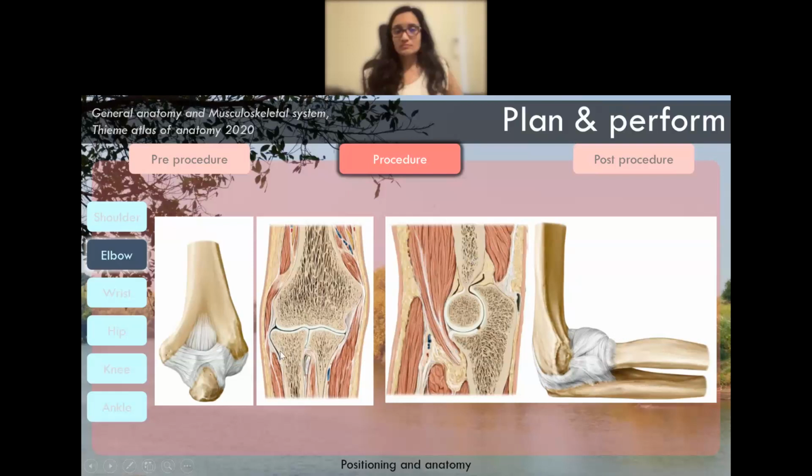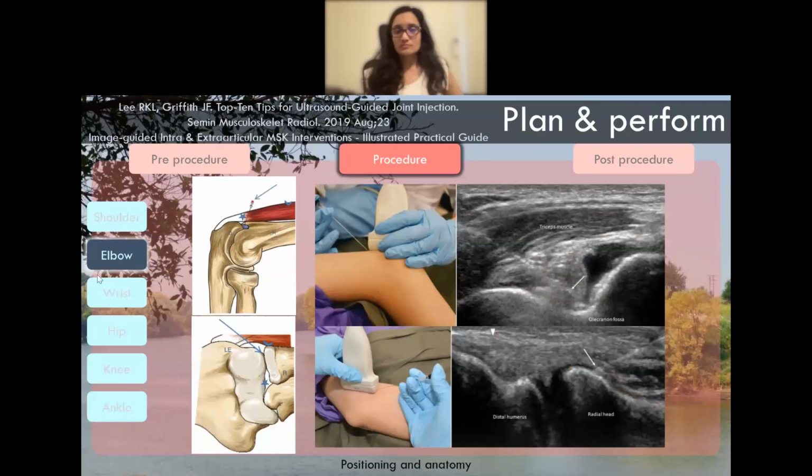This is the part where the radial head and neck junction is. This part is a bare area where we can safely land our needle tip without even worrying about injuring the articular cartilage. So this first one is the example of the posterolateral approach. Here the elbow is flexed, and this is the crawling crab position, and the forearm is a little pronated so that we can easily access this posterolateral recess of the elbow joint.